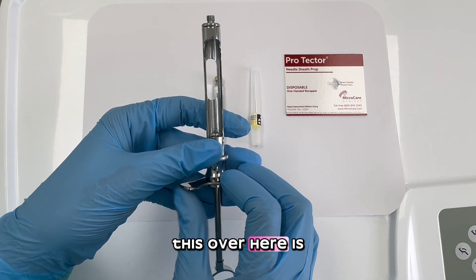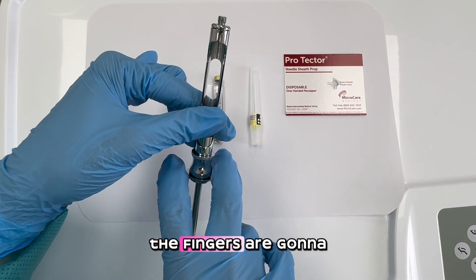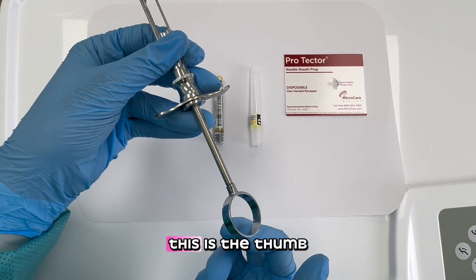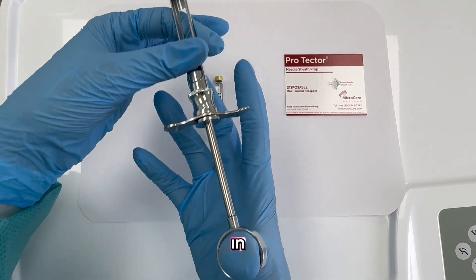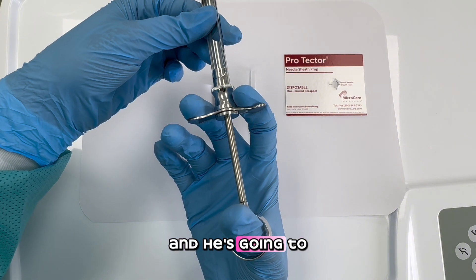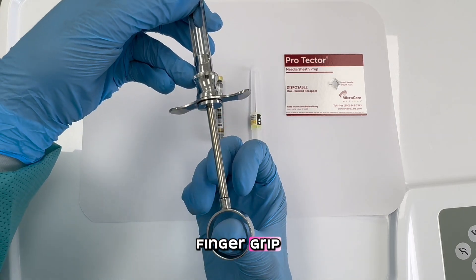This over here is the finger grip — where the fingers are going to be placed. And over here, this is the thumb ring, where the thumb goes in. The doctor is going to put the thumb through here and rest the fingers on the finger grip.